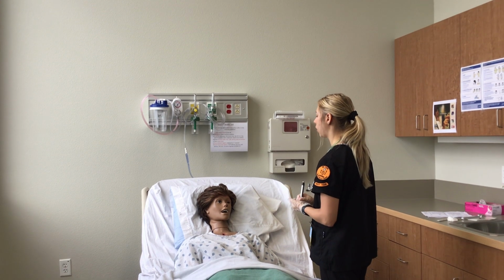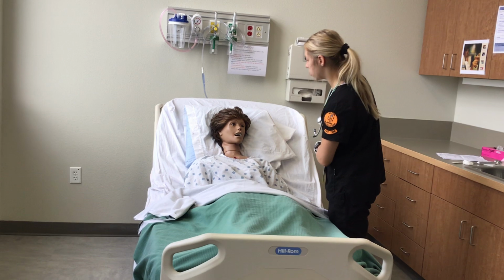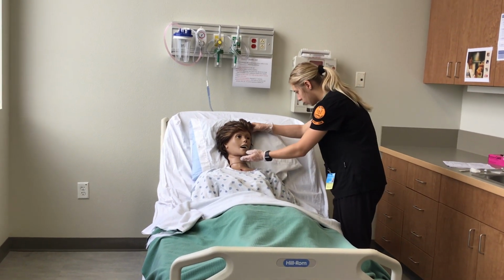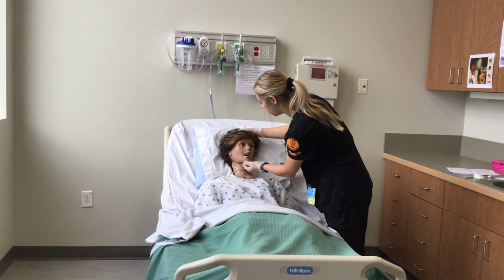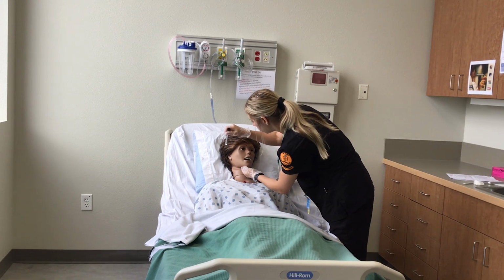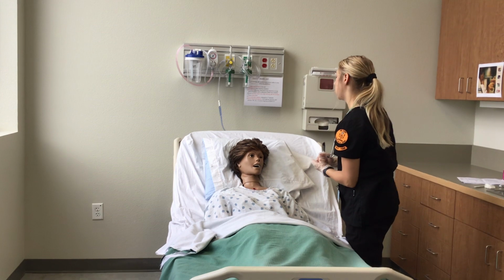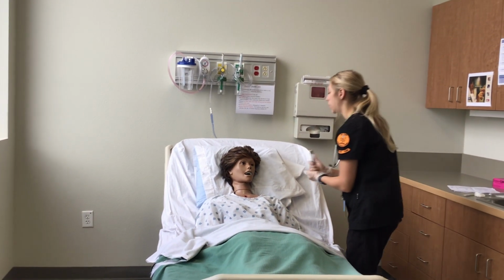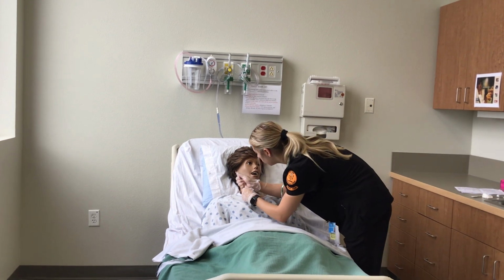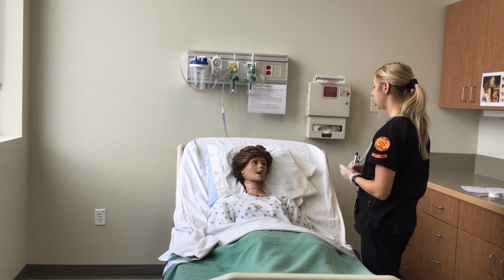And so now I'm going to move on to the ears. My patient's ears are symmetrical and even with the head. No discharge is noted in either ear. I'm now going to further assess my patient's ears by looking in them with an otoscope. My patient's canal and tympanic membrane are normal.